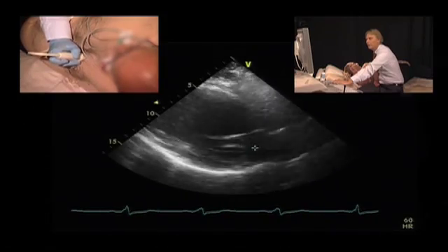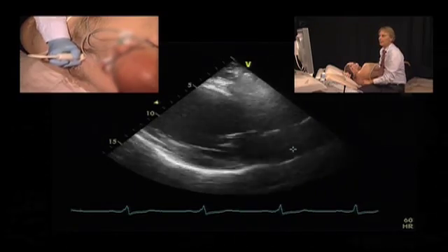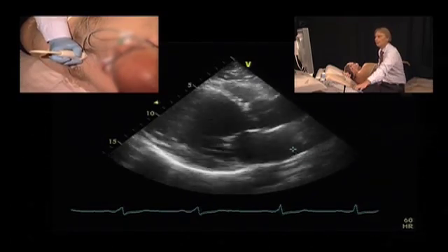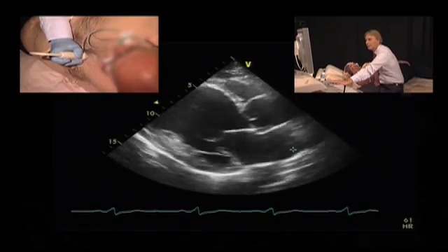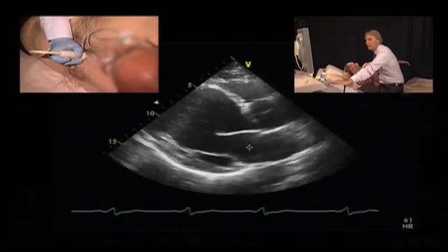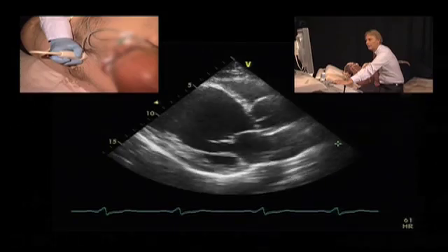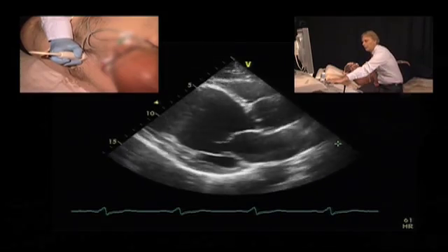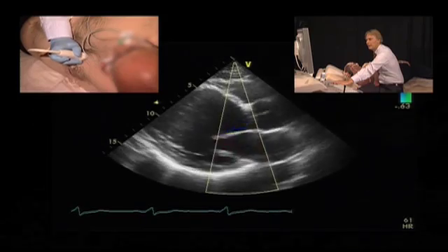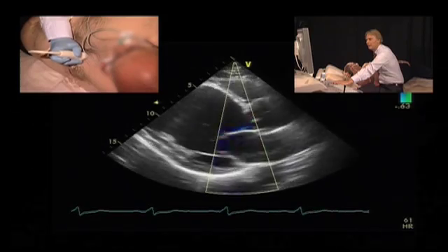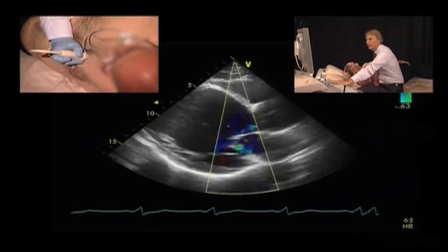Very important is the motion of the mitral valve. We can see that the mitral valve has a myopathic motion, which is caused by the reduced cardiac output, simply because the valves are not pushed open. We can also take a look at mitral regurgitation. We see that there is some degree of MR, which is probably mild and not significant.